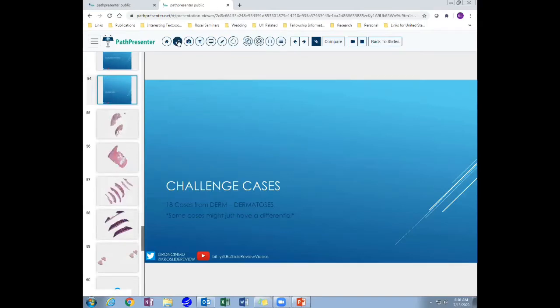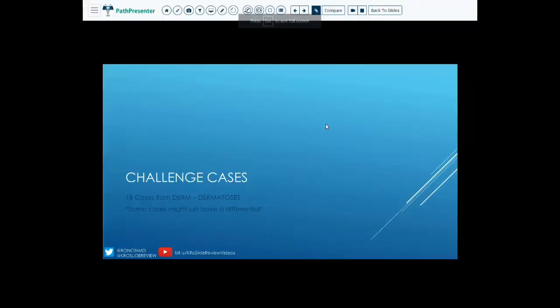and bring this back to full screen. So we have 18 cases we're going to go through, so we're going to go through them very quickly, try to hit the main points, and hopefully this is helpful. Again, challenge cases just really trying to give you a few more examples of some of these entities, because I feel like seeing more cases of them, seeing different varieties of these entities can be really helpful to learning more about them. So let's get started.